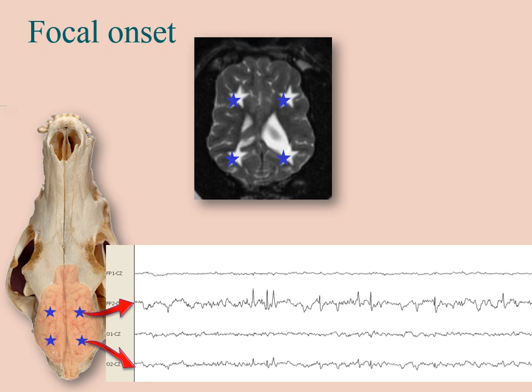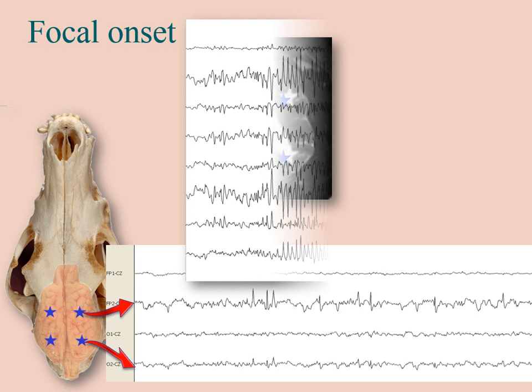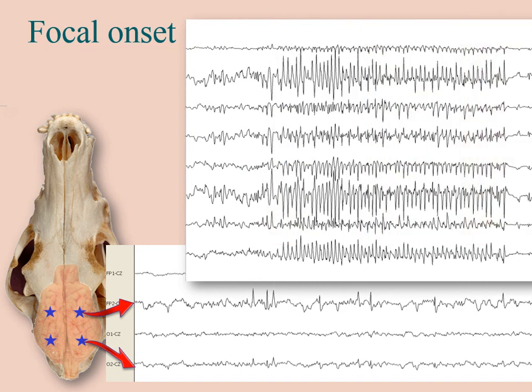electrode is located. And superimposing that on the MRI, we can see we've got some dilated ventricles on that side. This dog's obviously suffered some brain damage on that side. And so we've got a focal epileptic discharge there. Now, that other recording that you saw was this same dog a few minutes later. So a focal discharge like that can spread.